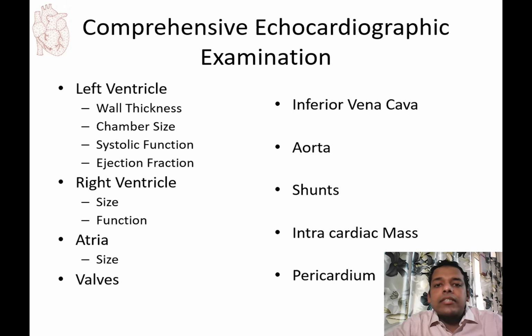The detailed discussion of valvular and shunt lesions would be done in future webinars after we have discussed color and Doppler echocardiography in detail.